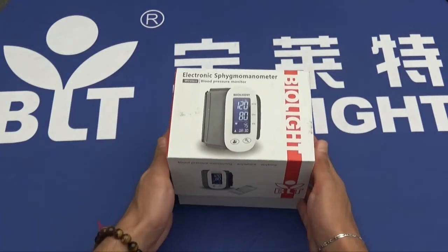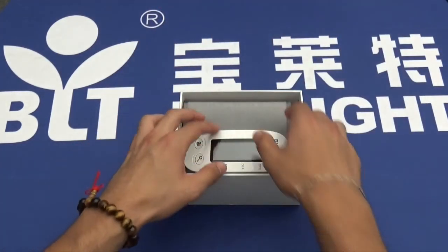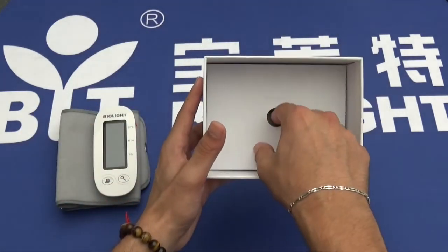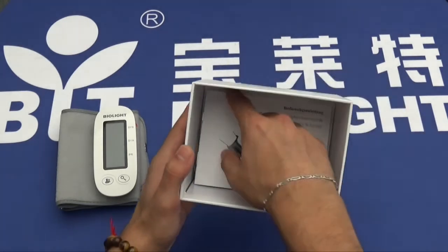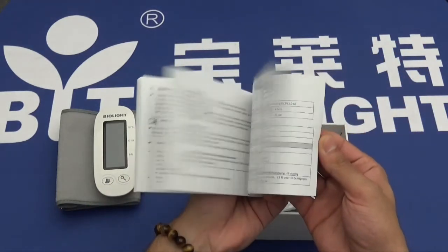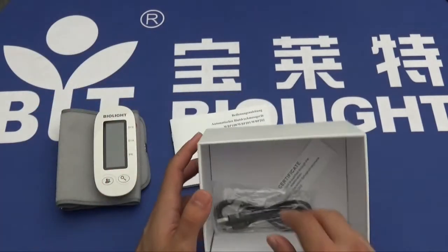Opening the box, we will find the device itself, some more packaging, the user's manual, and a charging cable.